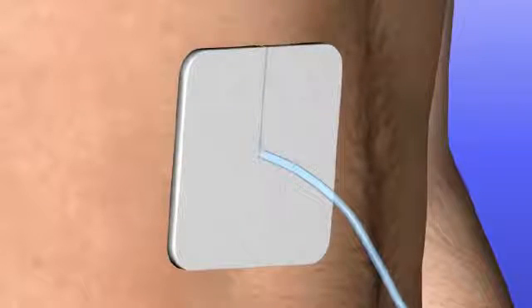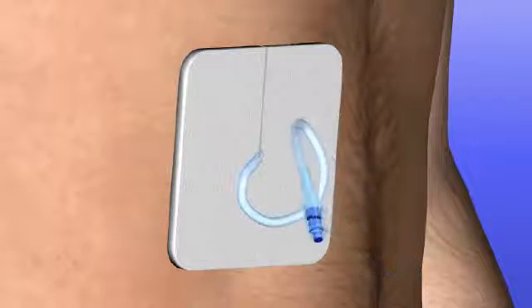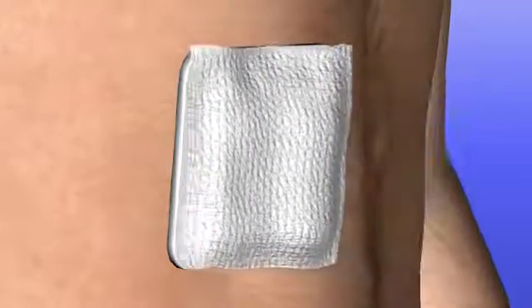Place the foam catheter pad around the catheter. Curl the catheter around in a circle and place it on top of the foam pad. Be very careful not to kink the catheter. Place the gauze pads over the top of the catheter and hold them down.